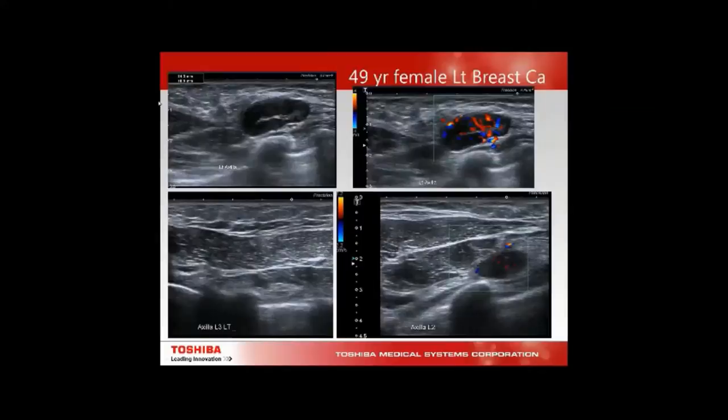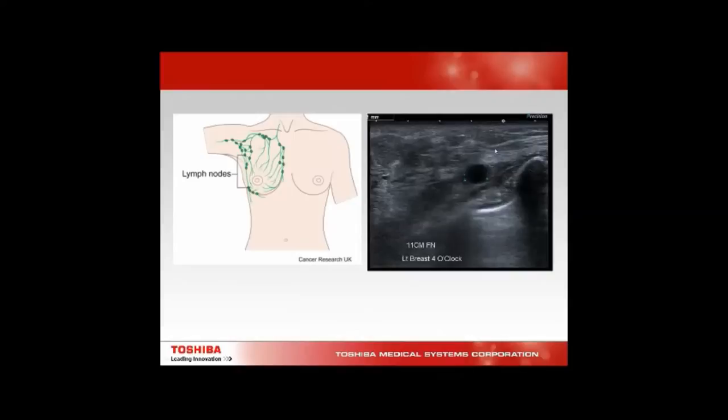Here we have a 49-year-old female with a 5 cm breast cancer. We have the pec major, an abnormal axillary level 1 node, and an abnormal axillary level 2 node. Her axillary level 3 nodes are normal. Scanning all the way down to about 4 o'clock, she also has an abnormal node at 4 o'clock.